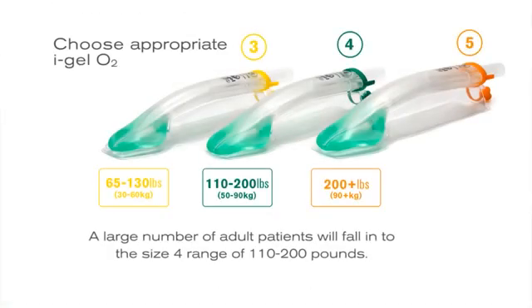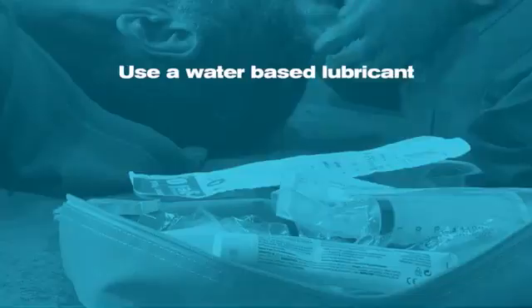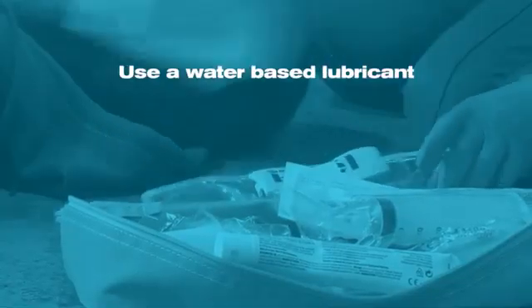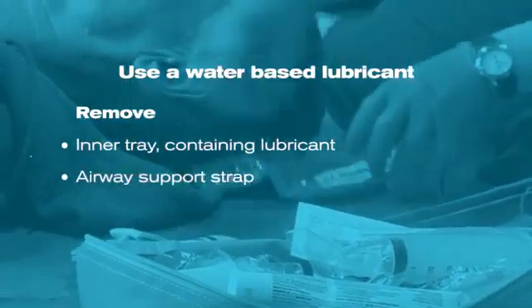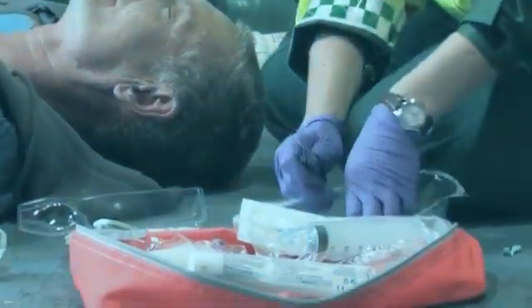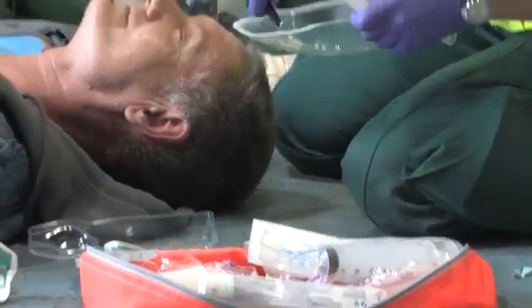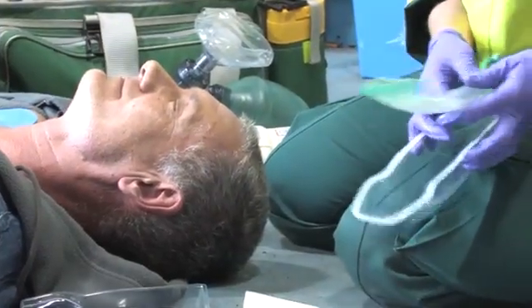First, decide on the most appropriate size of Eye Gel O2 to use. Correct size is normally determined by weight. Open the Eye Gel O2 recess pack, remove the inner tray containing the lubricant and an airway support strap, and place the contents to one side within easy reach. Place a small bolus of lubricant on the base of the inner side of the main shell of the packaging.